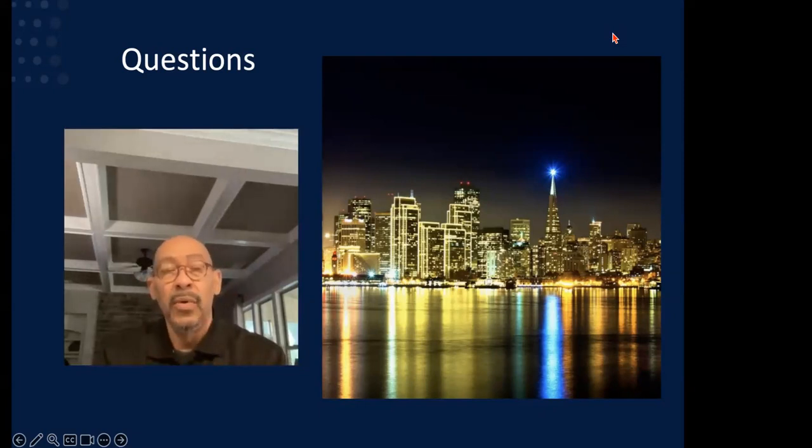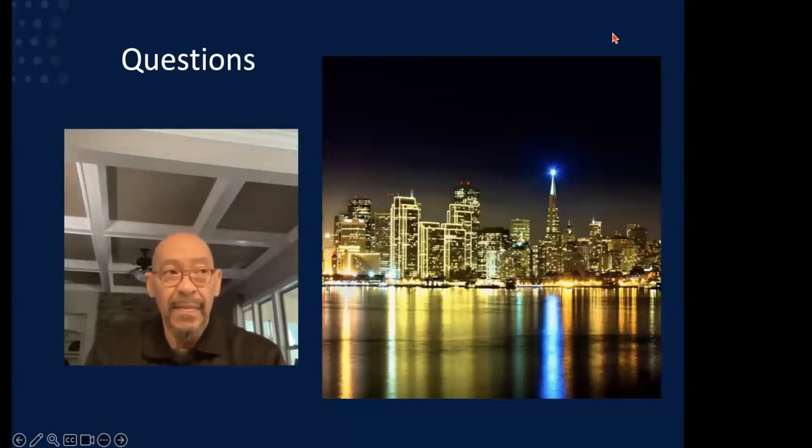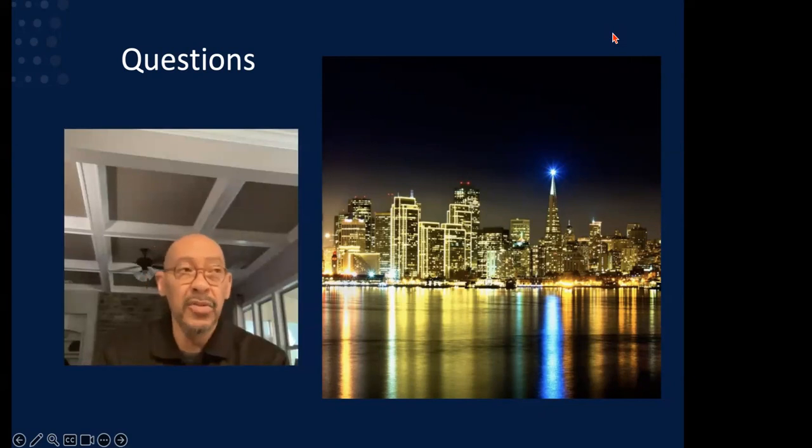What happens with ocular surgery is we grow these tissues. I'll call it a scar tissue, but it's a clear kind of scar tissue across the surface of the lens or around the edge of the lens. And the challenge with that is if you want to do a lens exchange, and this is not a clear lens exchange, this is, I've had cataract surgery and now I want to put a new lens in the eye, you have to dissect that stuff out. And that is really time consuming. And you've got to be very careful because mistakes with dissecting that out cause all kinds of other issues that the doctor may have to deal with.